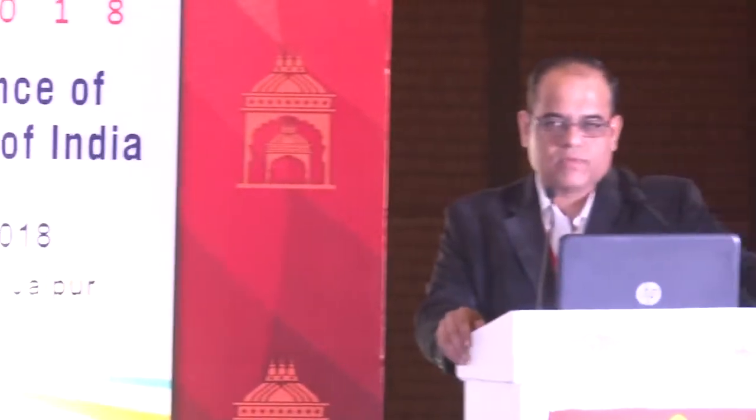The ones which are commonly used were handheld irrigating lenses, of which there are three in a set, which give 20 degree, 30 degree, and at the most 60 degree view for peripheral vitrectomy, and they need a good assistant to hold the lens.